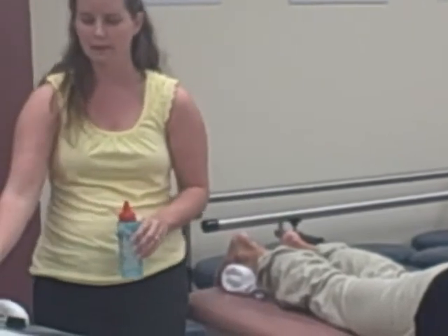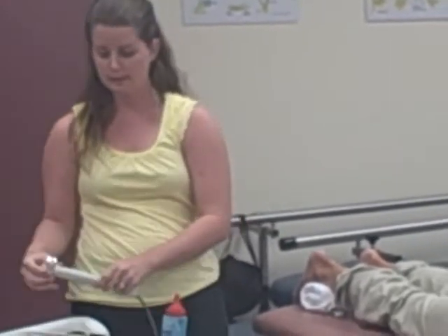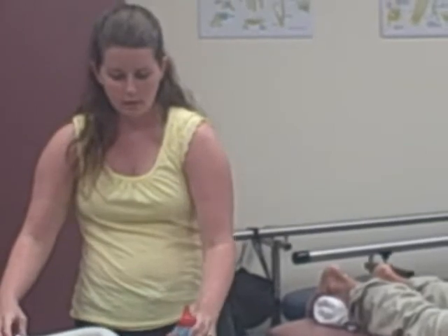And then when choosing the size of the head, you want to use the size that's going to be half. Because we're treating the Achilles tendon, a small area, we're going to use the 2 centimeter side. And then we need to set the ultrasound machine up. For my frequency, I'm going to use 3 megahertz because the Achilles is fairly superficial, 1 to 2 centimeters deep. And the intensity is going to be 0.5 watts per centimeter squared. We're using a high frequency, so we're going to use a low intensity. The duty cycle is 20% because we're going for non-thermal effects to heal the tendon and the surgical incision. And then the duration is between 5 to 10 minutes, so we're just going to go with 7.